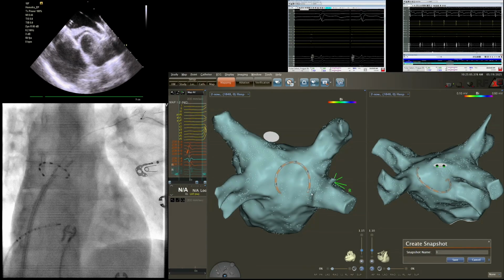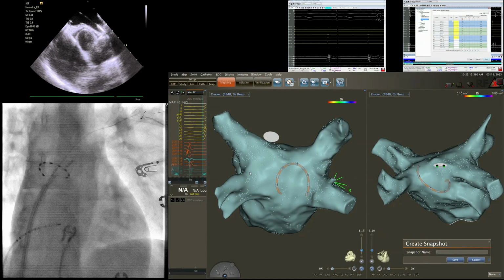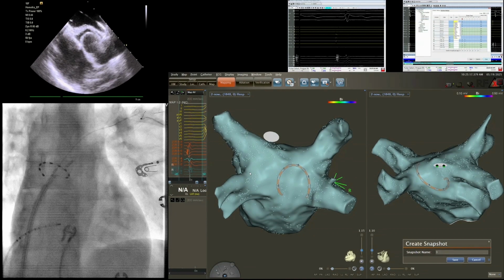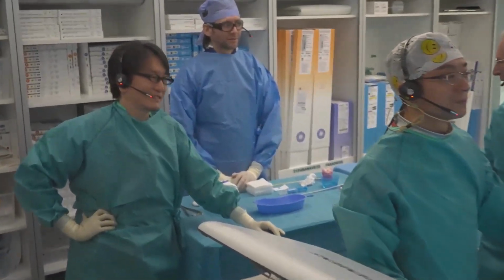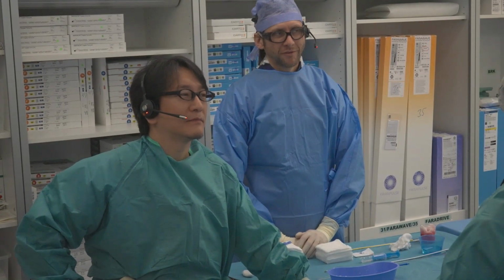And I must admit that it's our 3rd patient with Pulse Select. I did my first patients Saturday to train, to run in. So it's like my 3rd patient. And Ken Kakita from Japan, from Kyoto, is highly experienced with Pulse Select patients, he did over 100 patients.